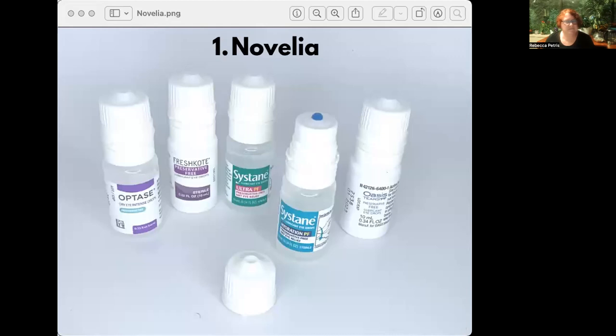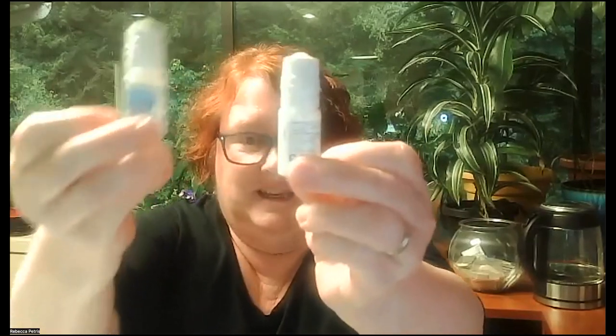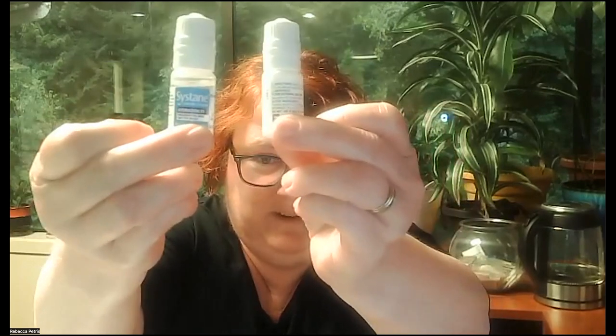We're going to start with the Novelia bottle. This is used by several brands: FreshKote, Optase, Systane, and Oasis - I think Oasis was the earliest one to do this. It generally works very well. One thing I do find annoying about this bottle is it's hard to tell whether it's been opened. Can you tell by looking at this whether it's been opened or not? This one I know is brand new, and this one has been opened - it's just really hard to tell them apart. Since you need to use these up within 90 days of opening, it's probably a good idea to just use a Sharpie on them.